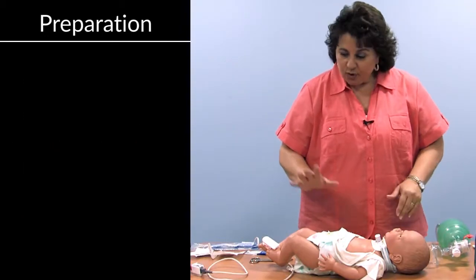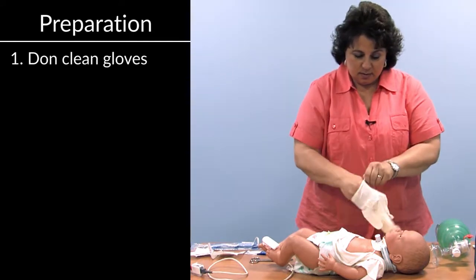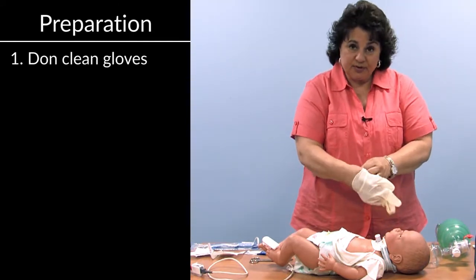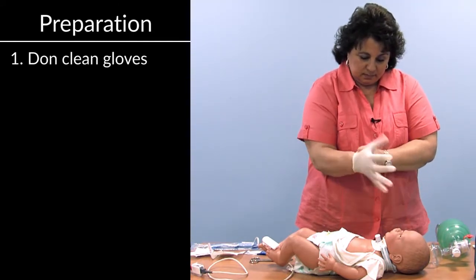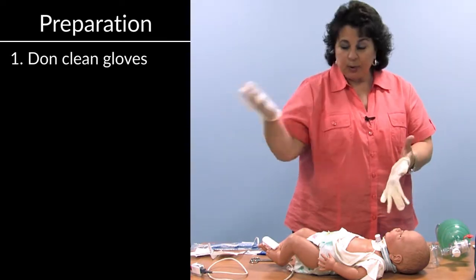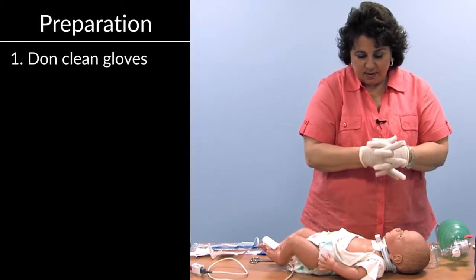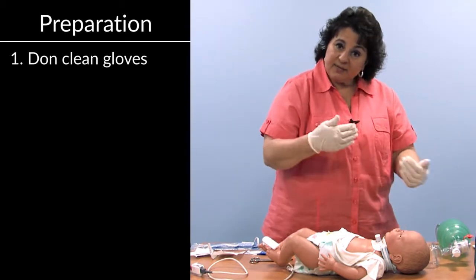So what I'm going to do is put on my gloves because this is a clean procedure. They would normally come out of a box, and we would wash our hands with Purell first. I'm going to have a second person here.